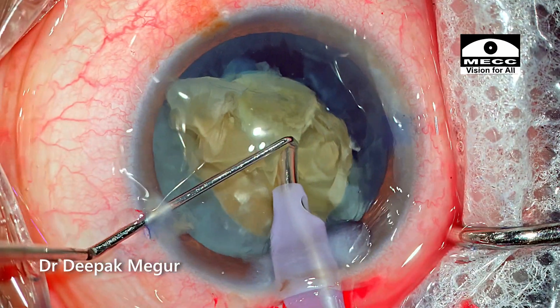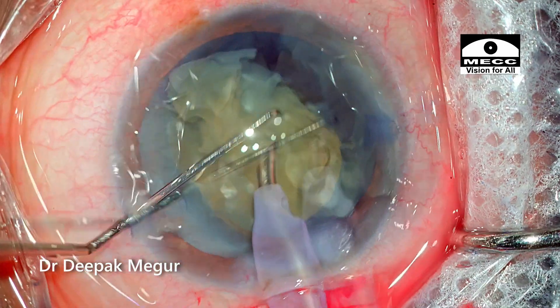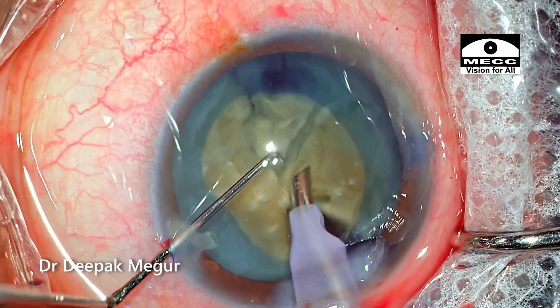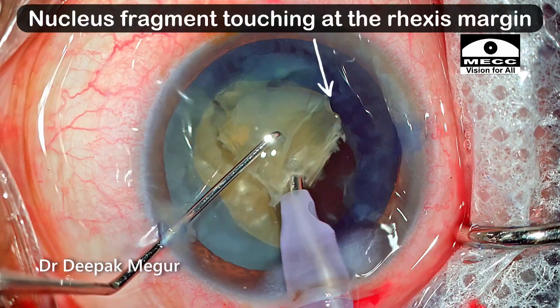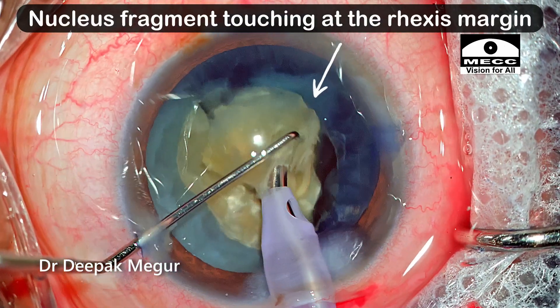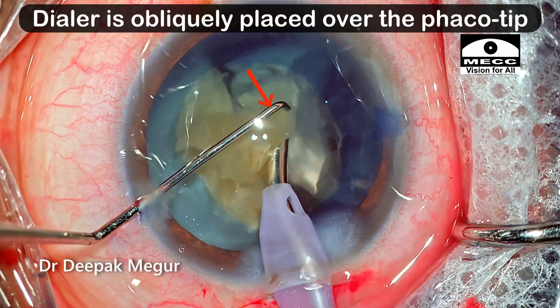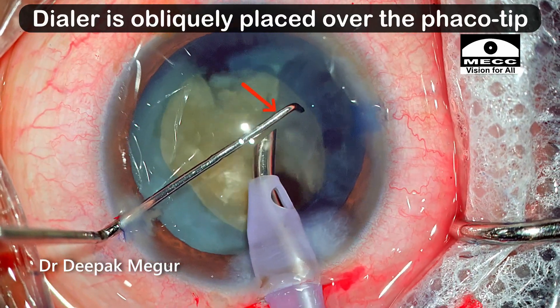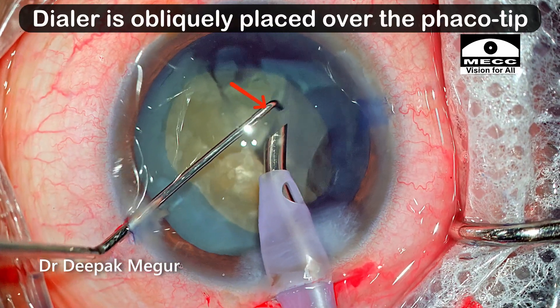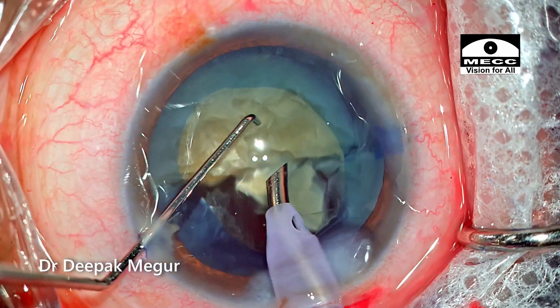The quadrants which have been cracked are being emulsified, and care is taken that the plane of emulsification is not very close to the endothelium — ensure that it is at the level of the capsulorhexis margin. Please note the position of the dialer: it is obliquely placed up and above the phaco tip so that we minimize the chance of any quadrants flying out and hitting the corneal endothelium.